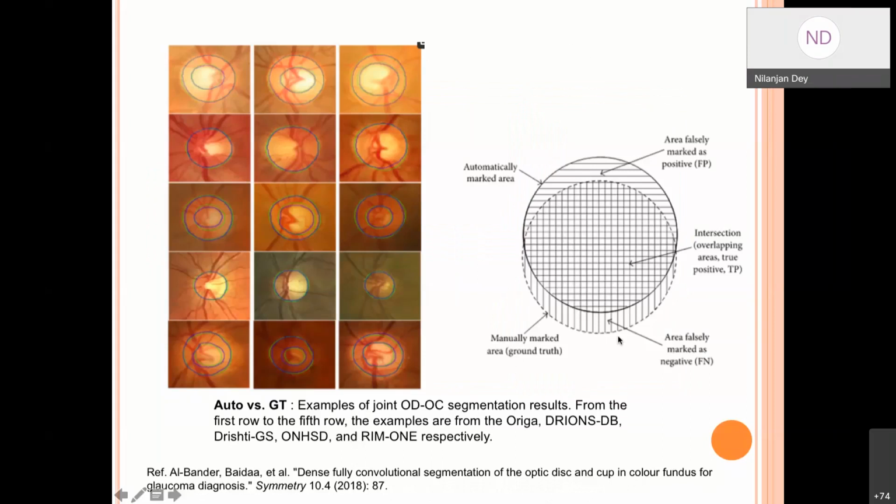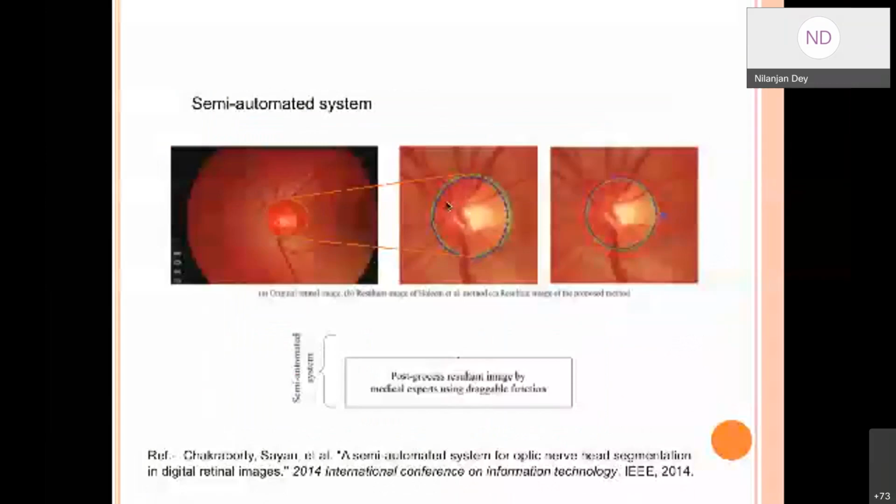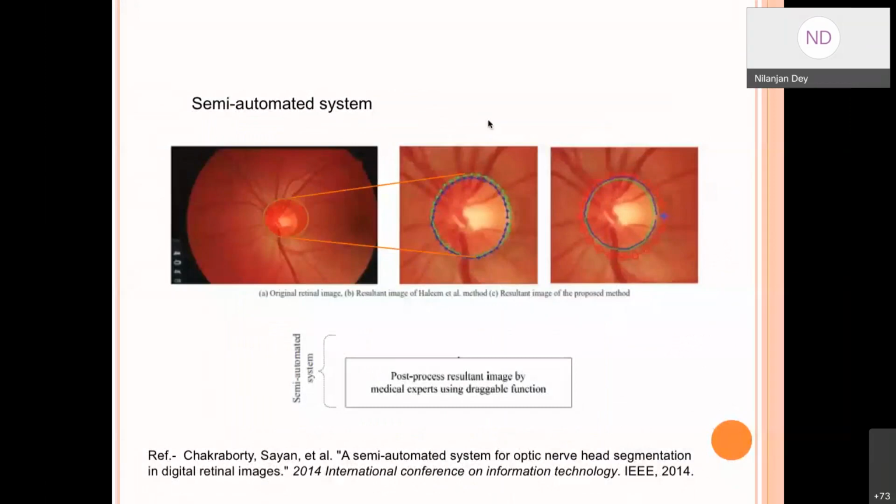semi automated system where we used to provide the doctors an interface by which those data needs to be properly tuned by the doctors by using human experience and expertise. In this way, we can also reduce the false positive cases. So this is semi-automated system. These are the tuners. So by tuning those, the doctors can come up with a good result, and that will actually improve the accuracy further. So it's a kind of post-processing as we used to do pre-processing. Similarly, post-processing also can be done for the semi-automated system.